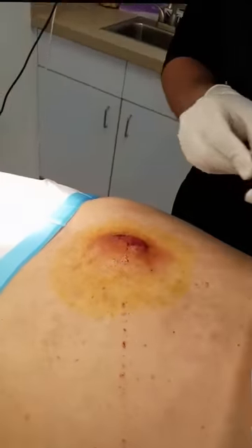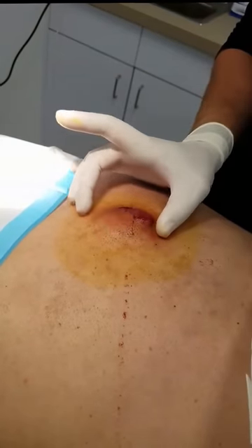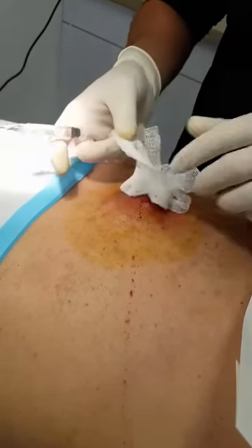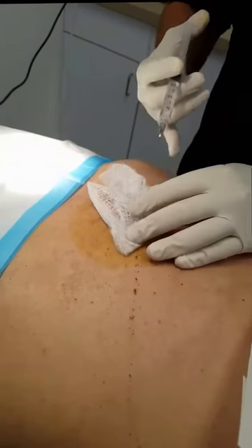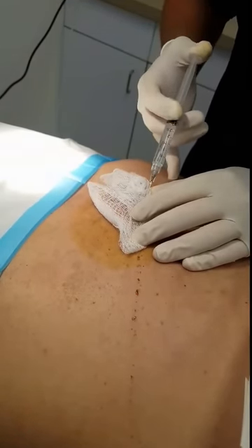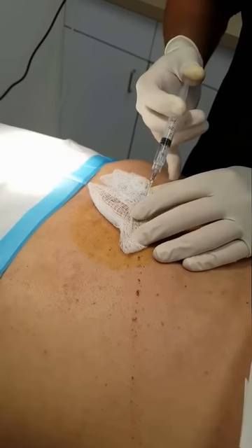Pretty large abscess as you can see, probably about 4 centimeters by 4 centimeters. Some lidocaine with epinephrine — go ahead and just inject through the gauze so that way it doesn't come back over you, and then just inject straight into it.